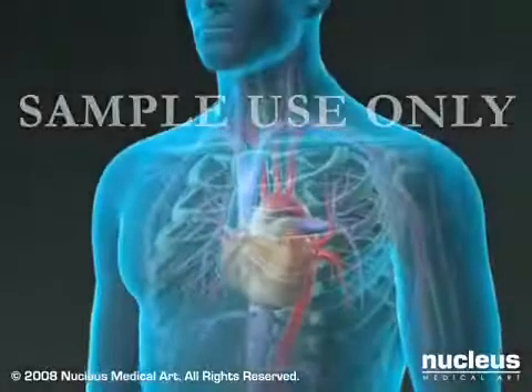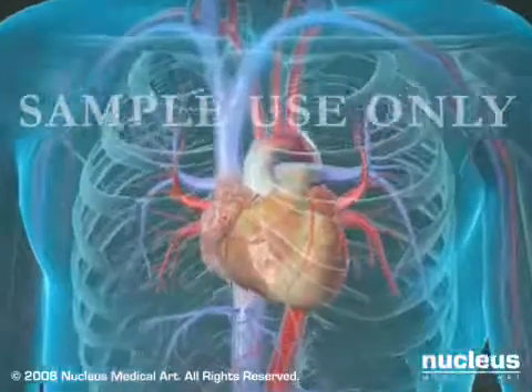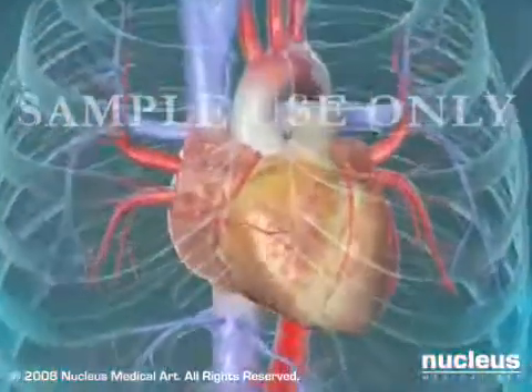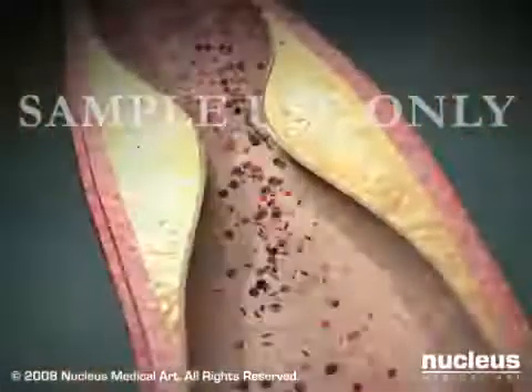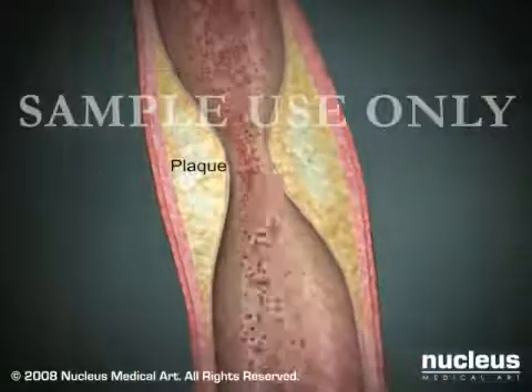Coronary angioplasty, also called percutaneous transluminal coronary angioplasty or balloon angioplasty, is designed to restore the flow of blood through coronary arteries narrowed or clogged by atherosclerotic plaques or blood clots.